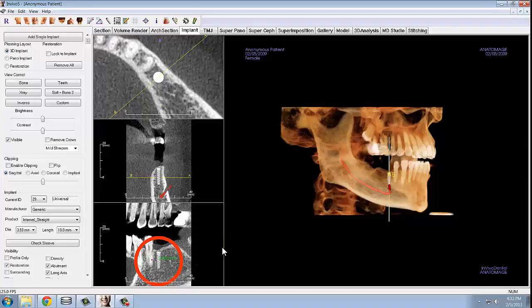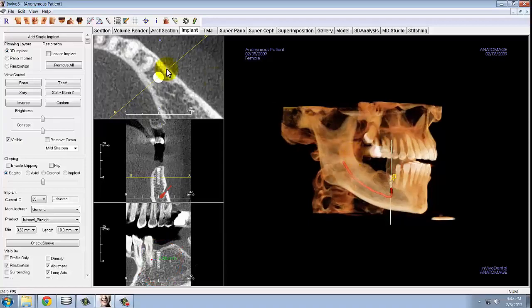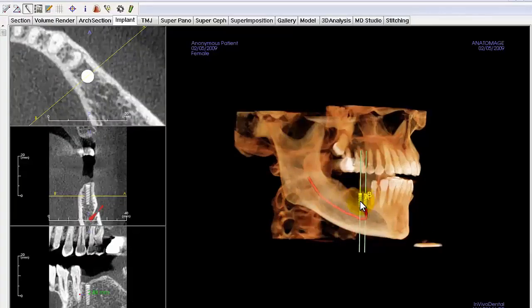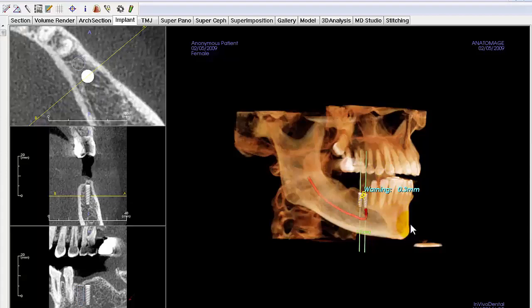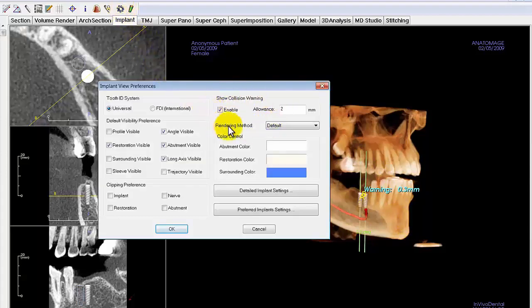Additionally, the cortical bone on the palatal side is stronger than the facial side. As you are placing your implants, you may see collision warnings that will tell you if you are too close to adjacent implants or the nerve. These collision warnings can be set in your implant tab preferences. Generally, it is good to have the collision tolerance set to at least 2 mm so you will always be alerted if you are getting too close to the nerve.